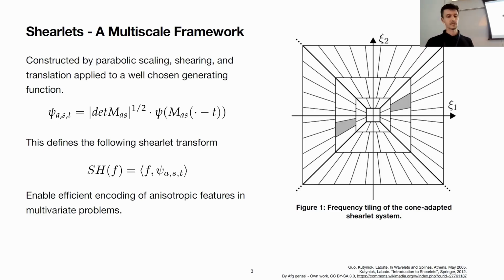This, of course, defines the Shearlet transform, which takes a signal, say a 512 by 512 scan, and transforms it to a 59 by 512 by 512 stack. 59 is considered the oversampling factor, and this can be handpicked, and it can also be decided by the actual Shearlet systems that you have implemented.